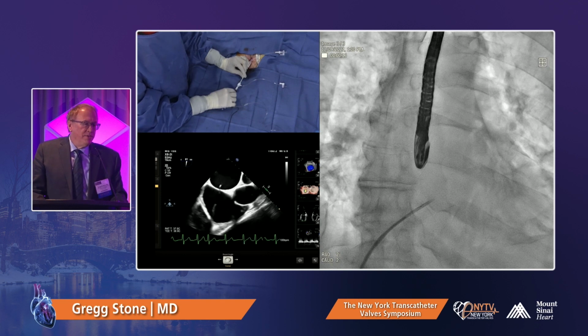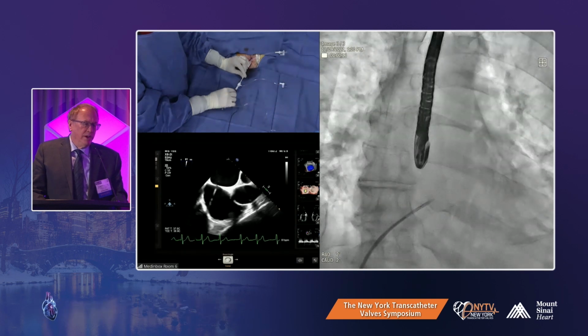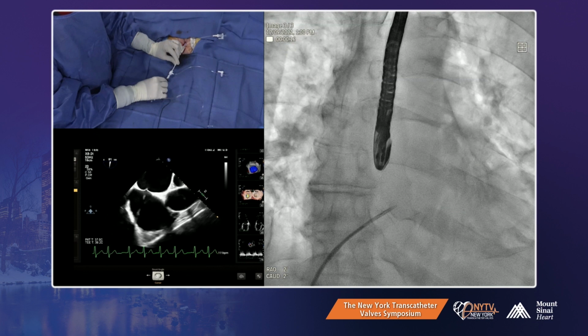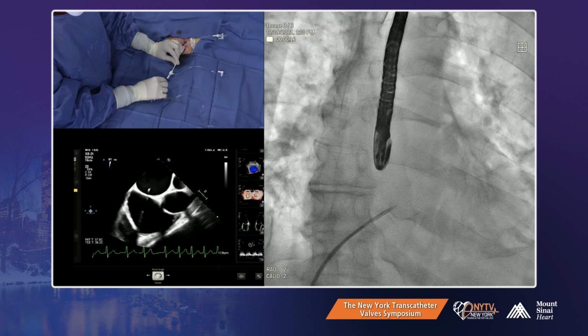What was the basis of the cardiomyopathy here? Was this ischemic or idiopathic? Idiopathic. It's maybe from the regurgitation point of view. Yeah, because there was fairly marked restriction of both the anterior and posterior leaflets, which is a little unusual, but it was mostly a central jet. But this is severe MR, and the LV is not too dilated, so I think this patient should respond very well to the MitraClip.